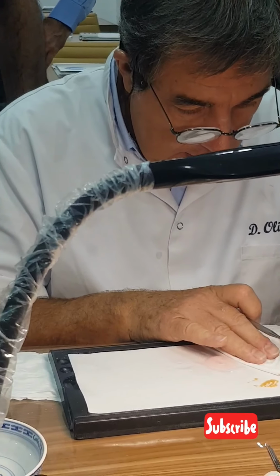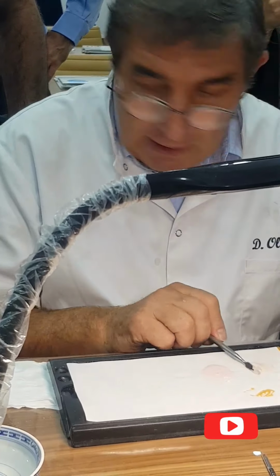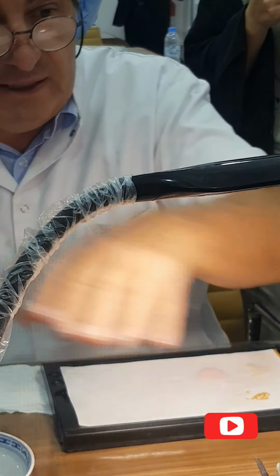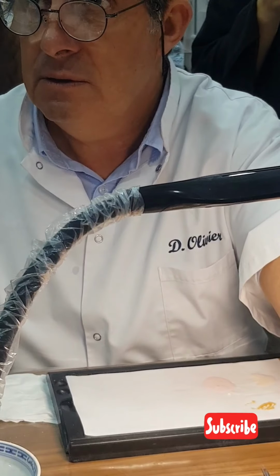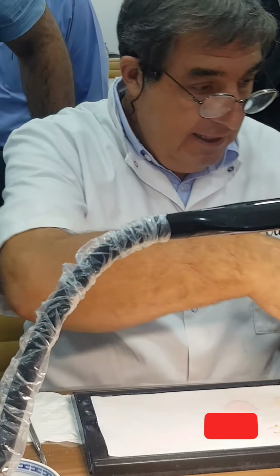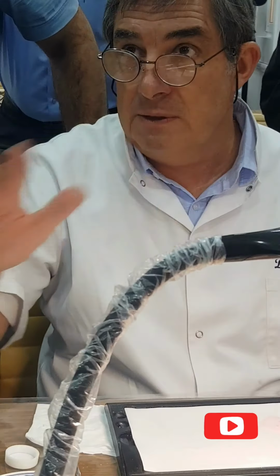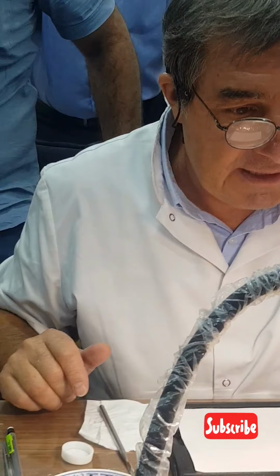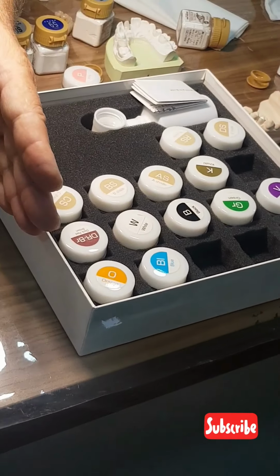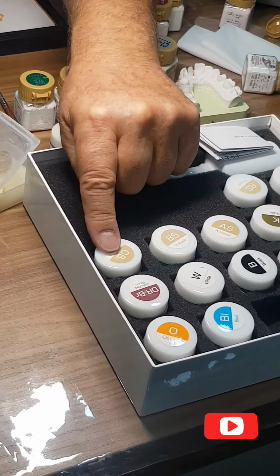Can this mix with any kind of ceramic? Any kind. That box is incredible. For the zirconium, you can stain directly on your frame. You can do what you want, and you have two kinds of boxes. That one, and another one which is quite different, where you have FCS.